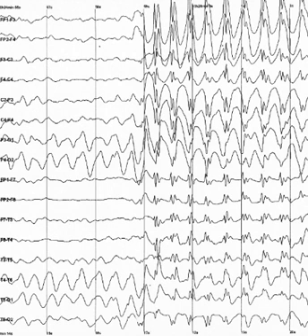Artifact correction. Recently, independent component analysis techniques have been used to correct or remove EEG contaminants. These techniques attempt to unmix the EEG signals into some number of underlying components. There are many source separation algorithms, often assuming various behaviors or natures of EEG.